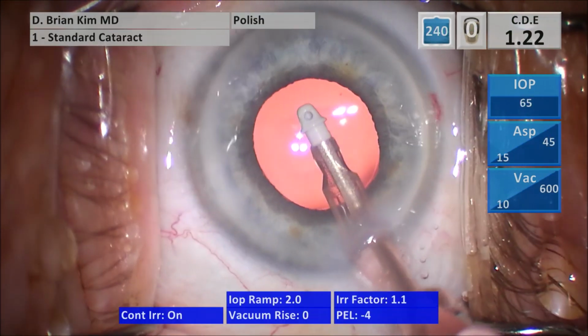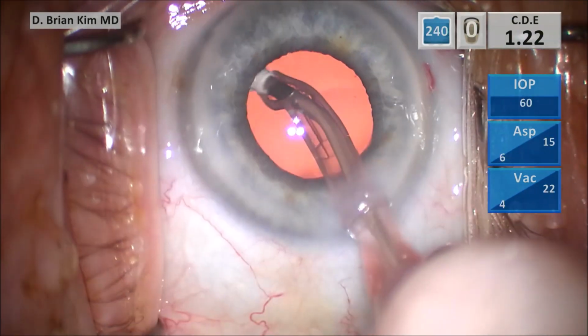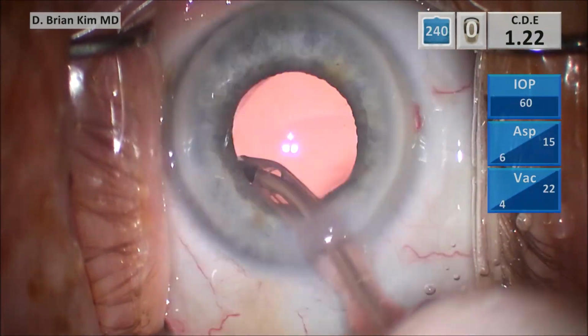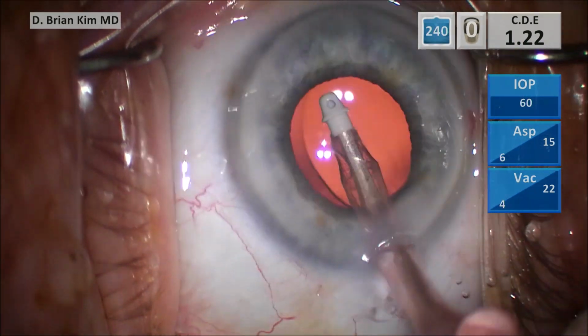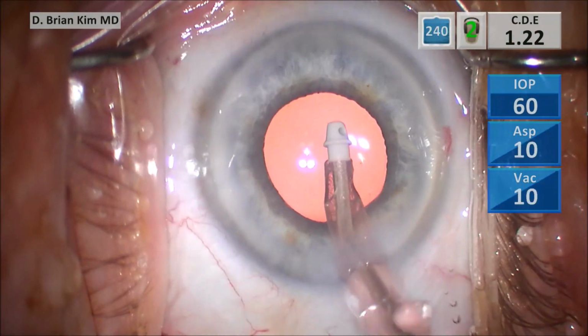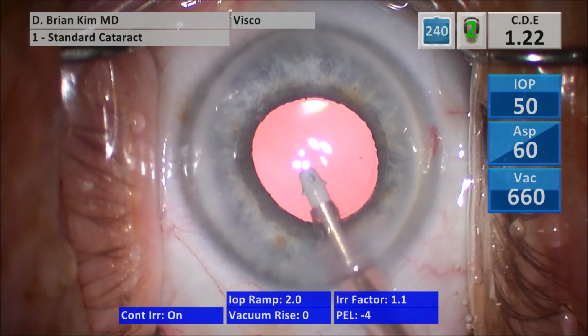I'm polishing under the rhexis edge, turning the lens haptics. Switch to visco mode, removing all the viscoelastic from the anterior chamber here, and then I'll hydrate my incision.